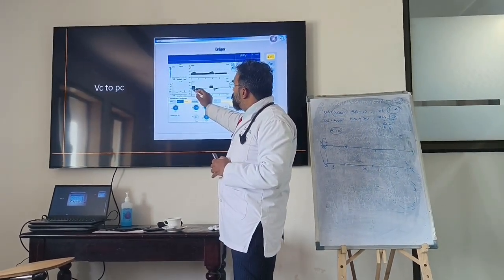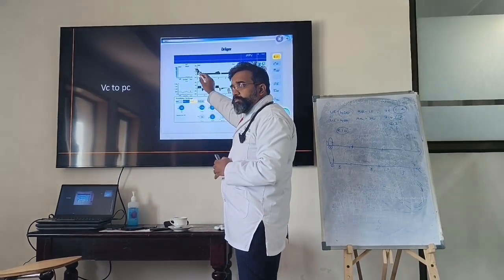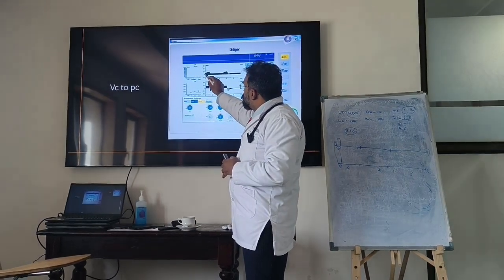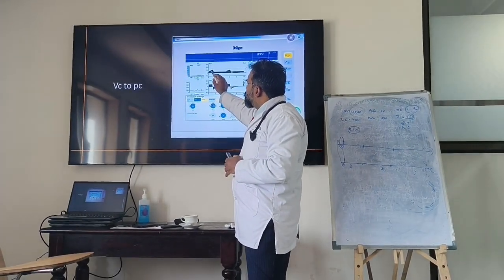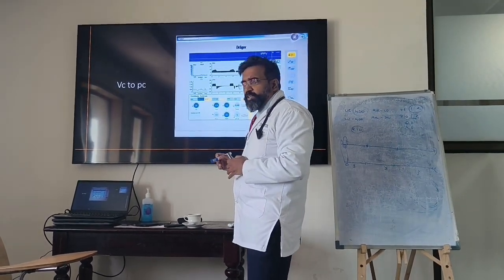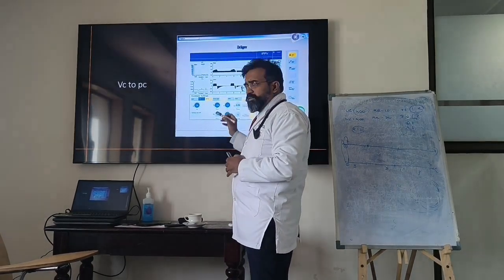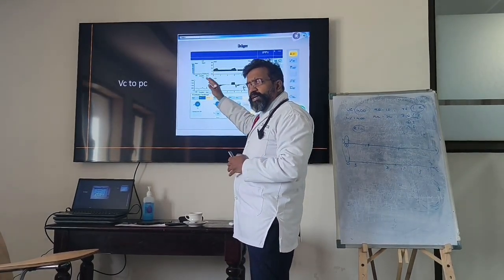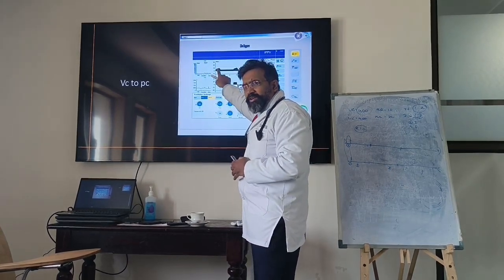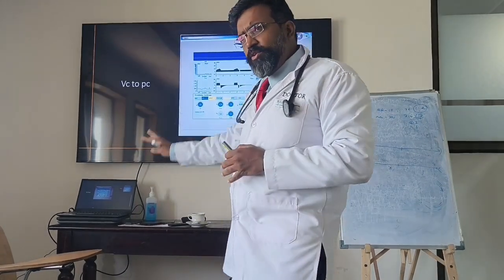What is this? What waveform is this? Pressure and time. Pressure is going up and coming down, but here the difference is there is no inspiratory pause, or only a very minimal inspiratory pause at the foot. And it is a square waveform pattern. This is probably machine triggered, volume controlled, because pressure is variable and it is time cycled. Clear on this? This is our usual volume control.